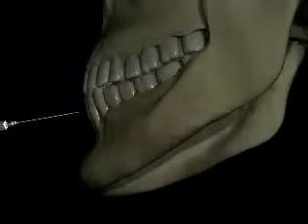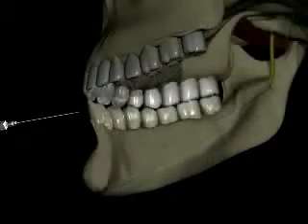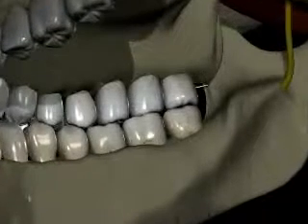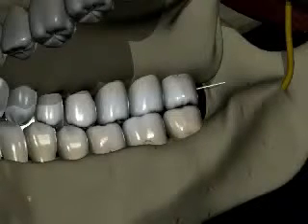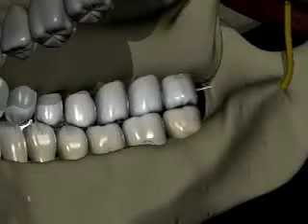No hard tissue should be contacted, but if you hit bone, it often occurs early on and is due to the coronoid process. This may occur if the insertion point was too far lateral and may be corrected by withdrawing the needle slightly and redirecting it around the obstruction.